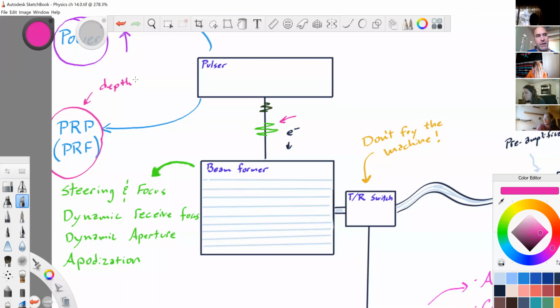At 10 centimeters, this is what your PRF is going to be. In color, it obviously starts with a certain PRF, but that function of pulse repetition frequency is Doppler only. You're not changing the grayscale background PRF. You're changing the color only, or the spectral only. And that, for kind of complicated reasons, changes our scale.